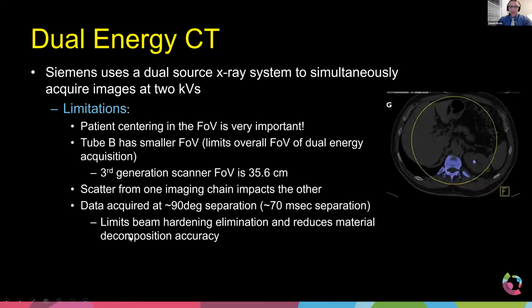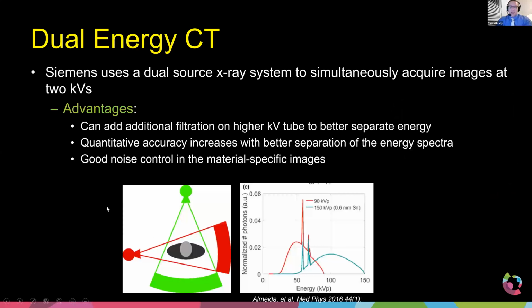And then finally, the fact of the matter is that the scanner itself, the X-ray tubes themselves are 90 degrees apart. In other words, as you image through this part of the body with this kV, and then you spin around and you image the other part of the body with a different kV, so one at, let's say 80 and another at 140, well, that's fine.